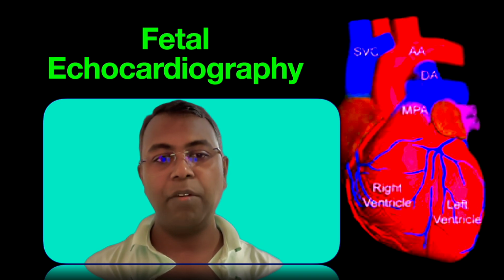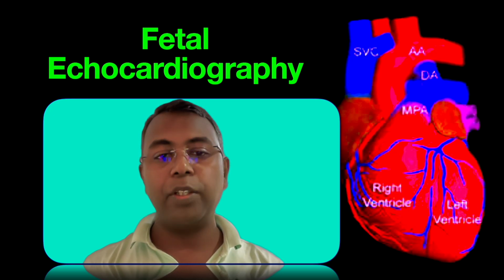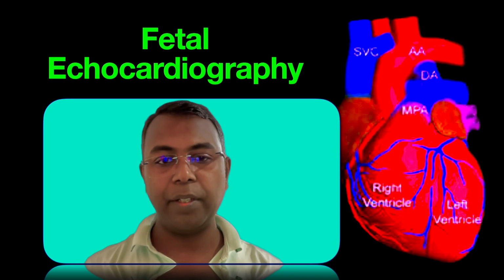You should keep in mind that there is some problem in the heart, and if I am not following all the steps of the echocardiography, then we may not come to a conclusion many a times.